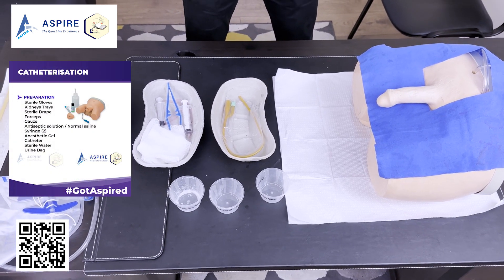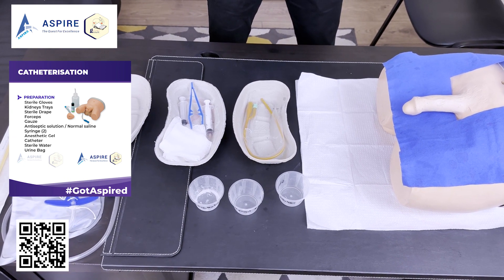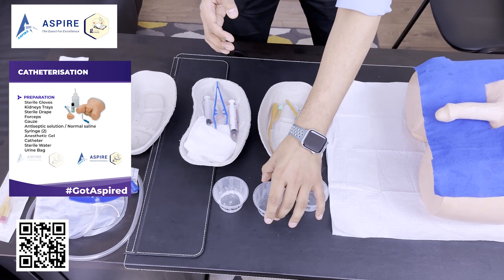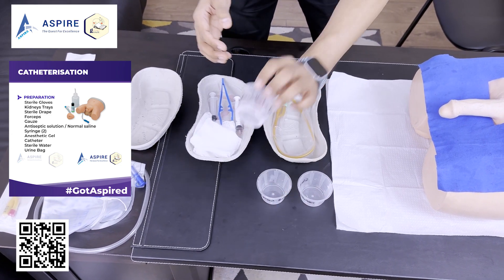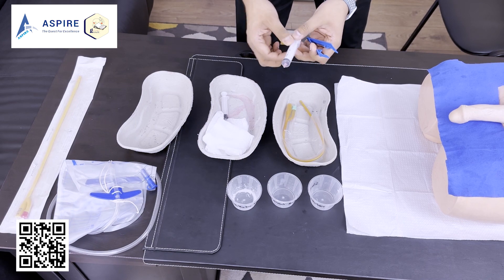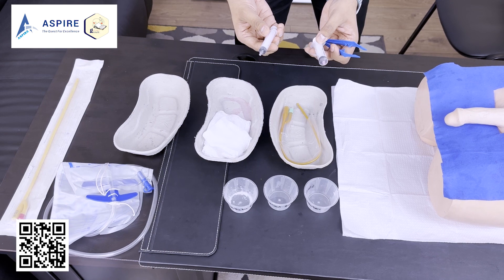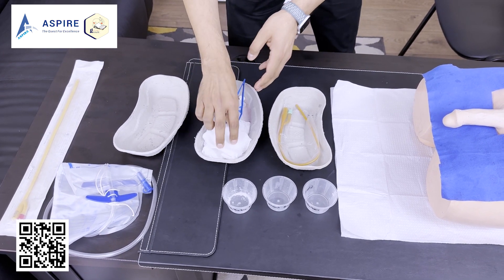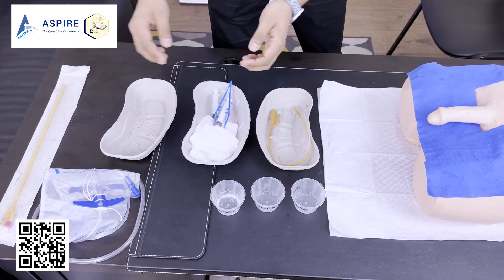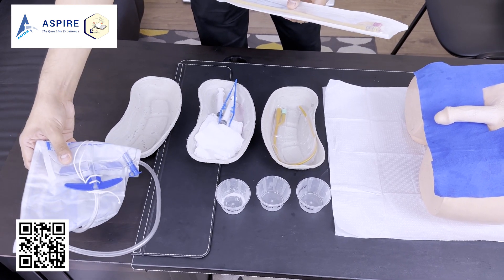First, check the mannequin — if it is not draped, you have to drape it. Make sure you are gloved when you do that. The equipment includes sterile water, normal saline, anesthetic gel, forceps, two syringes — one for the anesthetic jelly and one for the water — gauze pieces, the catheter, and a urine bag.